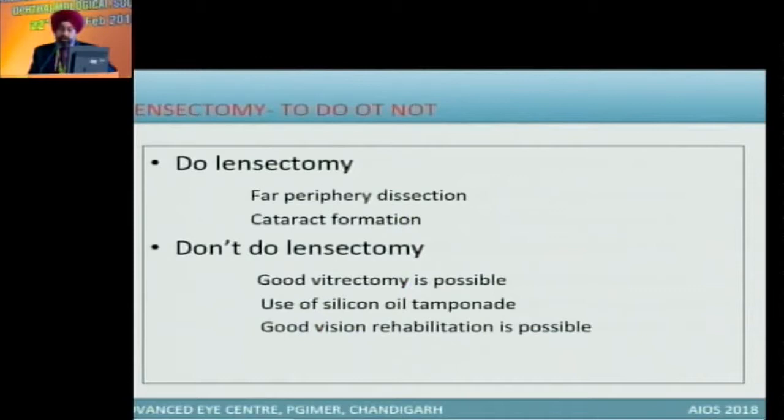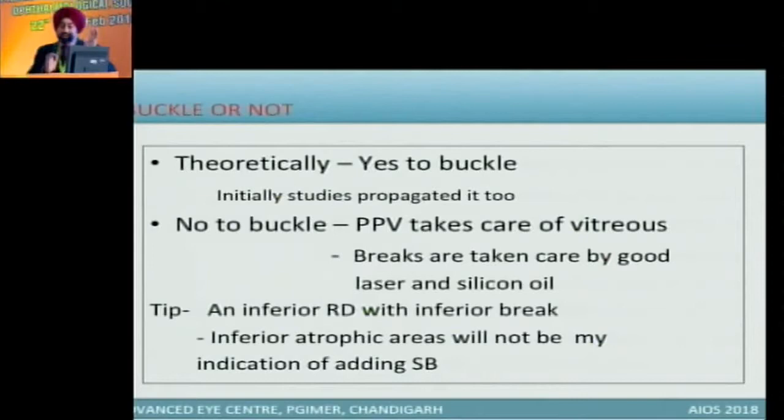Buckle or not buckle, okay, no buckle. Like Dr. Lingam Gopal said, choroid, the coloboma, no buckle because it is inferior. Here, the buckle is not required because most of the things are happening posteriorly in the posterior pole. So where the buckle is required, I have written there an inferior RD now.